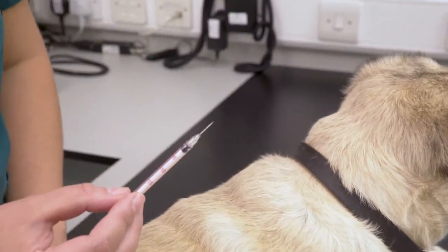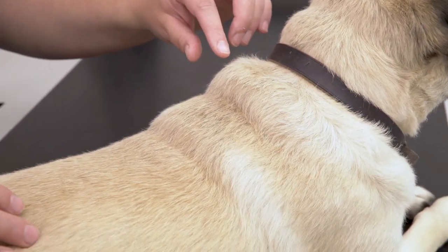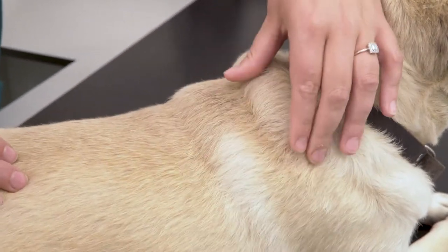Remember to dispose of sharps into the sharps bin. If your pet requires multiple injections it's important to rotate the injection site on a daily basis.